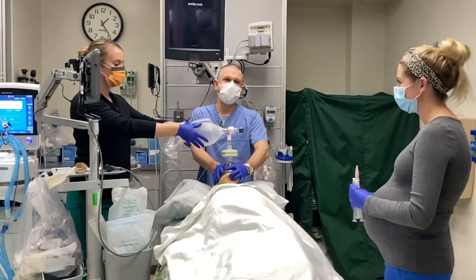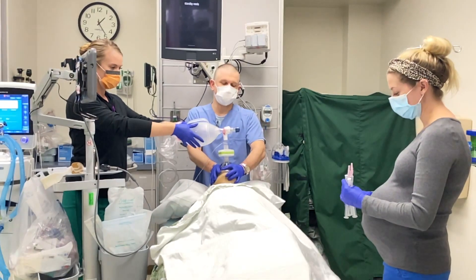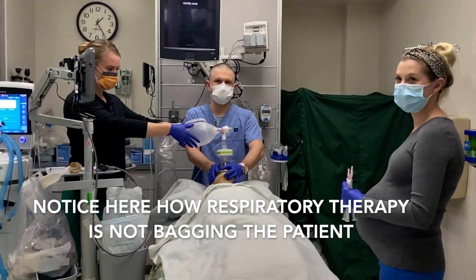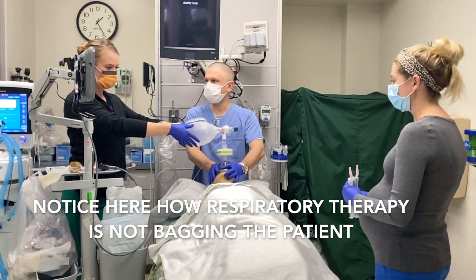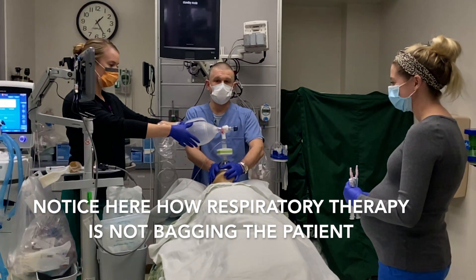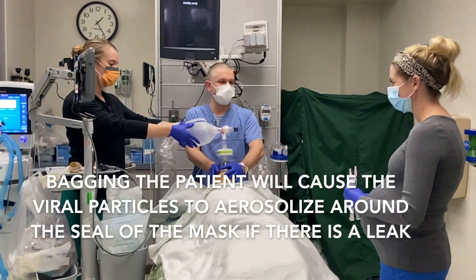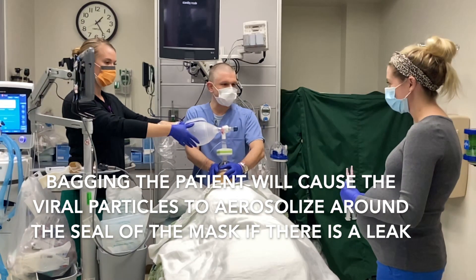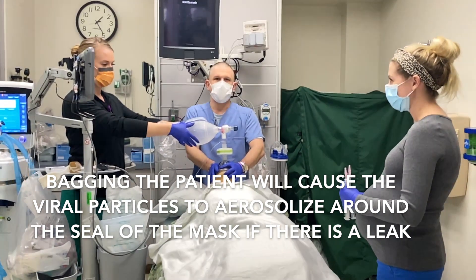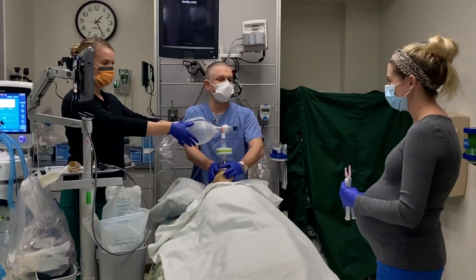We are at the end of our pre-oxygenation procedure and getting ready to intubate. The three people who are going to take part in the procedure are in the room. We have everything we should need, including our appropriate drugs drawn up by our nurse.